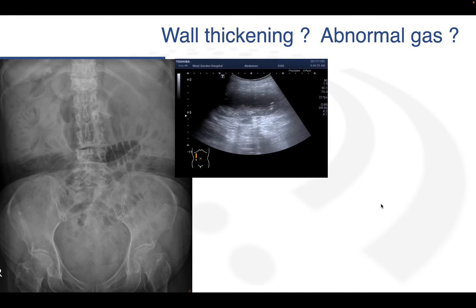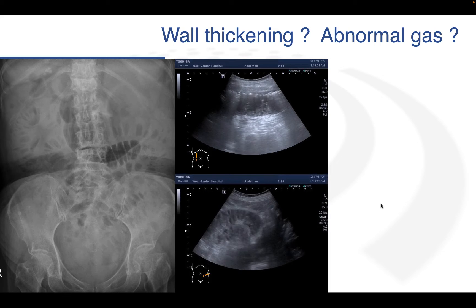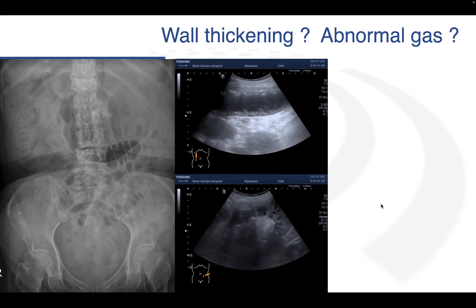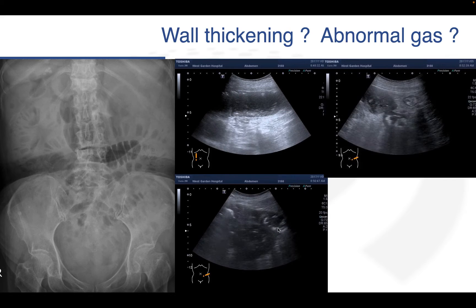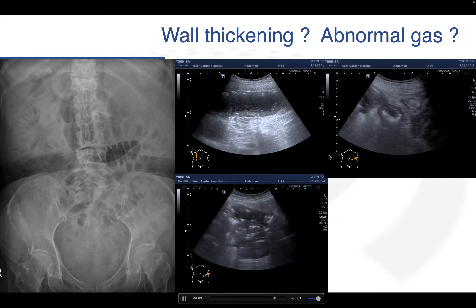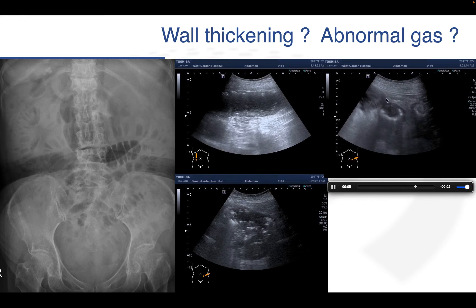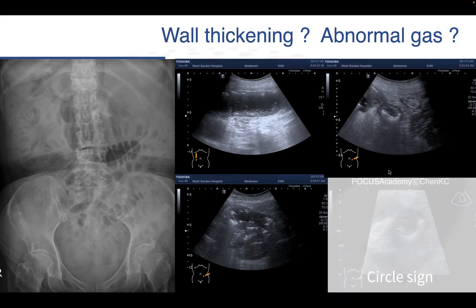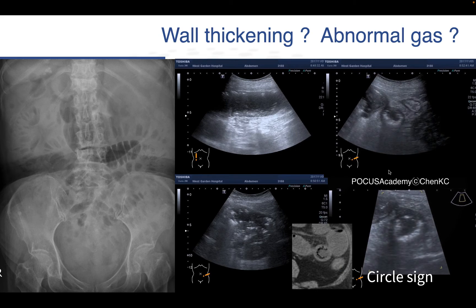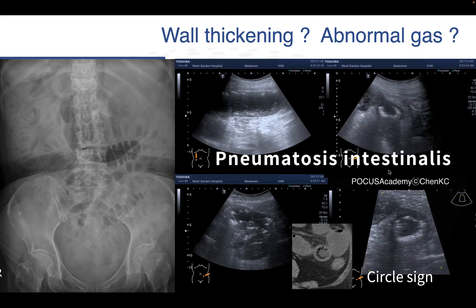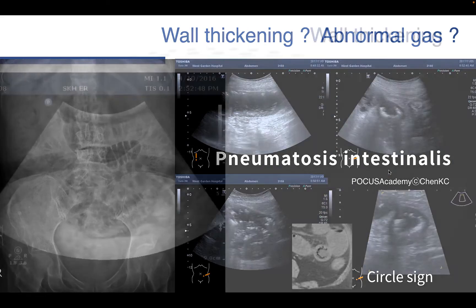We can see these small bowel loops distended. The wall is thickened. When we observe more of the segment, we see some abnormality. We zoom in on the structures and see hyperechoic gas located around the bowel wall. We call it a circle sign. When you encounter patients having a circle sign, it is always abnormal. It's coming from patients having pneumatosis intestinalis.